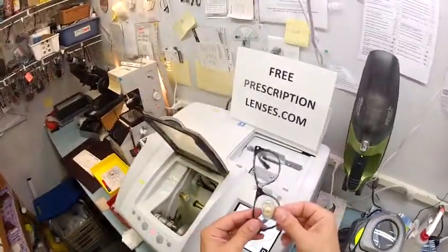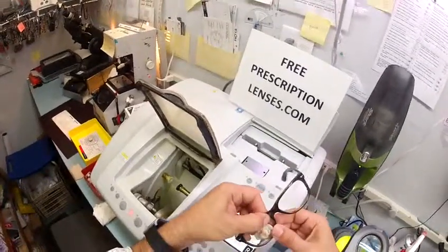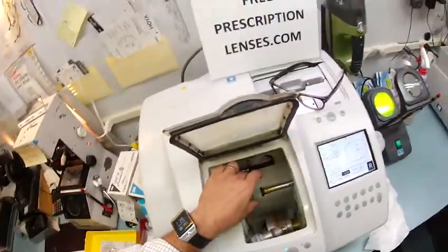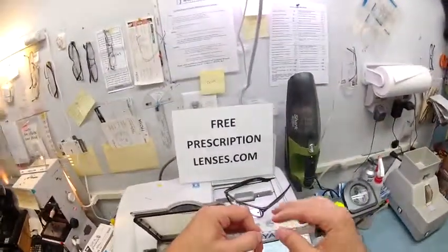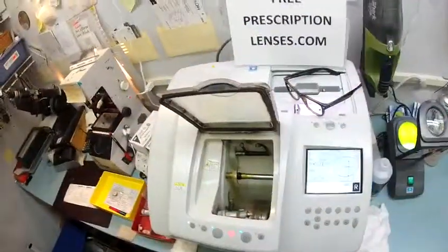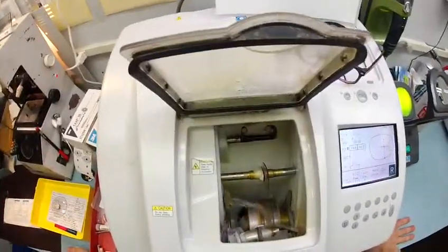In order to mount it, I have to tuck it in at the outside corner, and then using my thumbs I push down at the nose, and there's still a little bit of give. So I'm going to take it down a little bit more. I'm going to do 1/10 of a millimeter. And a millimeter is the distance between my thumbnails. I'm going to take 1/10 of that distance off all the way around the circumference of your lens until it will easily mount into the frame.